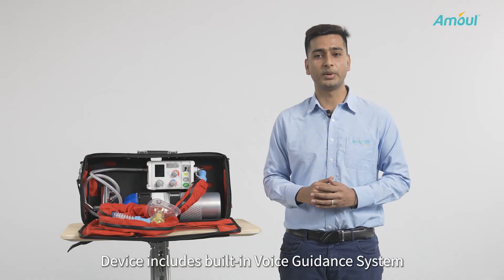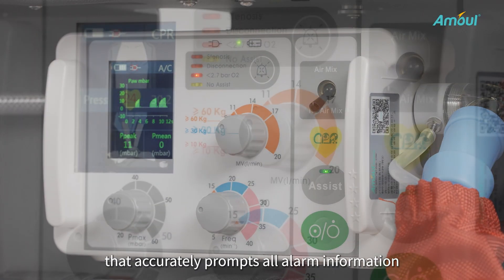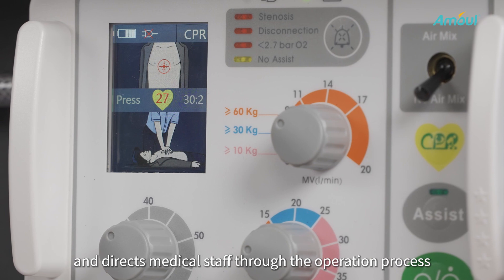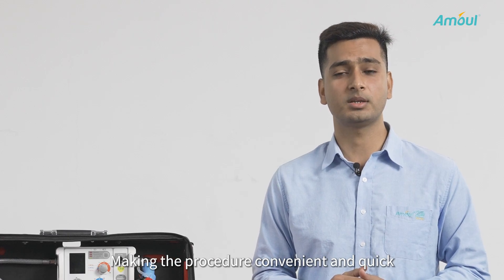The device includes a built-in voice guidance system that accurately prompts all alarm information and directs medical staff through the operation process, making the procedure convenient and quick.